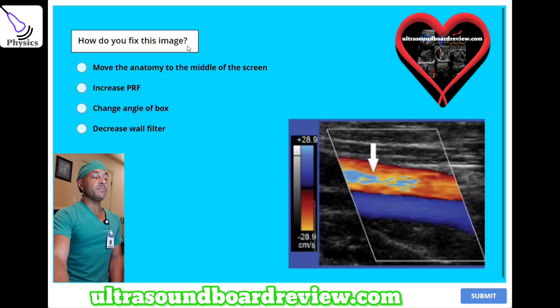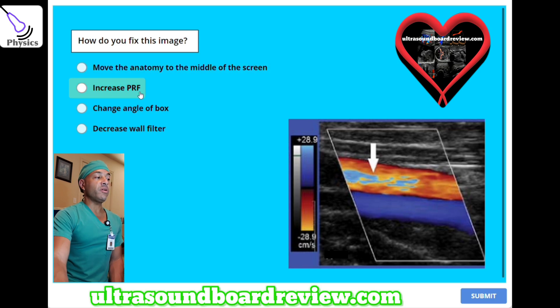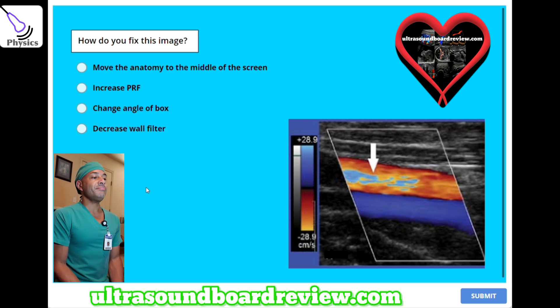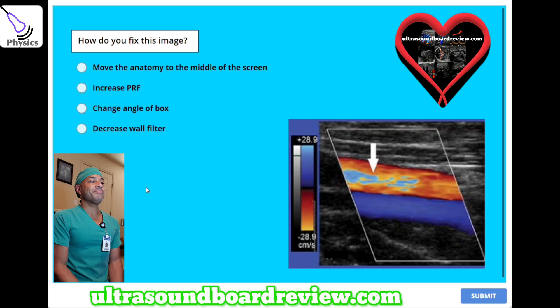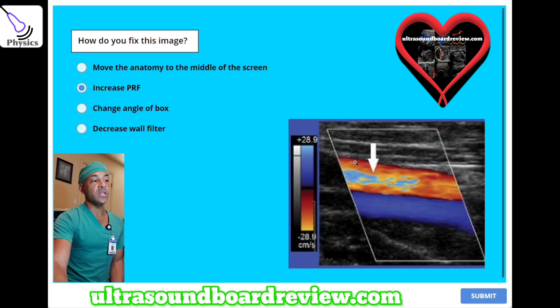How do you fix this image? A, move the anatomy to the middle of the screen. B, increase PRF. C, change angle of the box. Or D, decrease wall filter. The answer is B — increase PRF to eliminate this aliasing run effect.